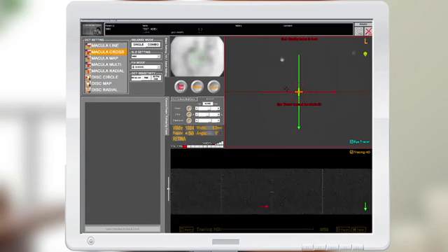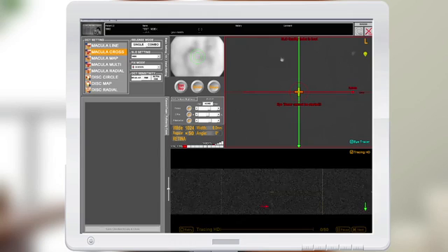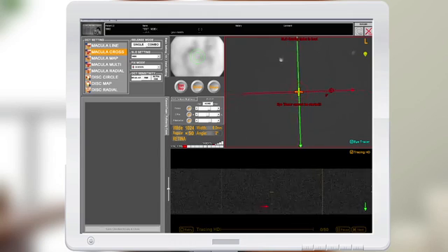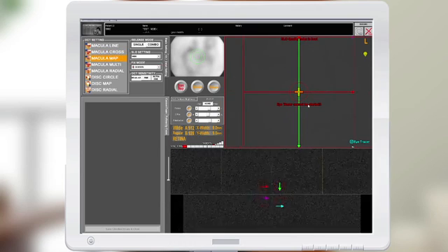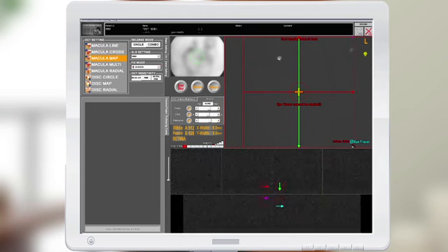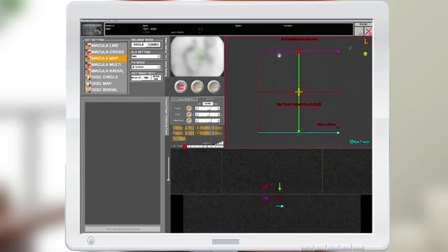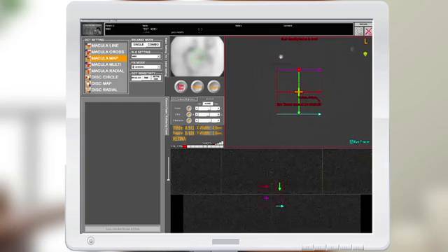The macula cross can be adjusted out to nine millimeters or rotated. The macula map defaults at nine millimeters by nine millimeters, or it can be adjusted down to three millimeters.